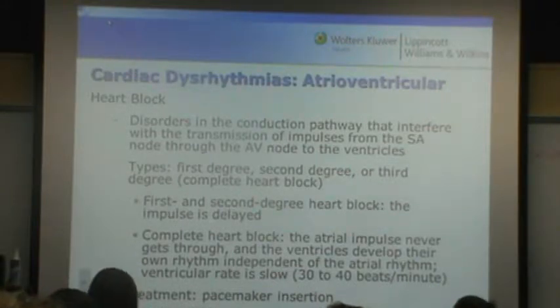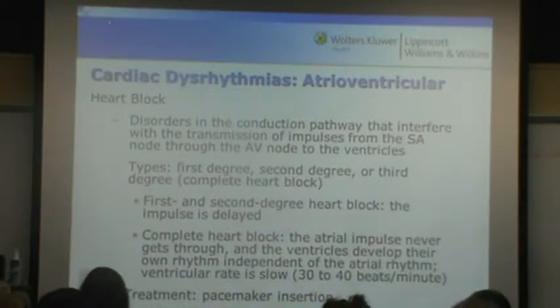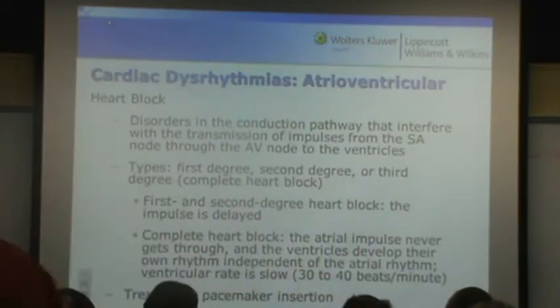What do we got? Heart rate 72, so it's normal. And they're all the same. So yeah, that one will be a normal sinus rhythm. Oh, you're fine. You're fine. All right.